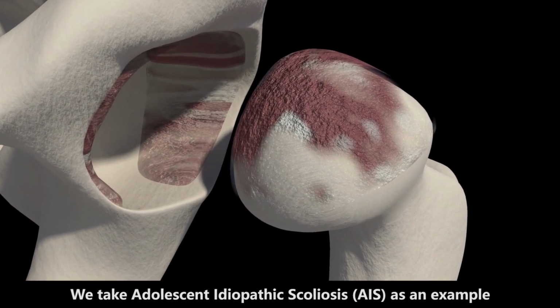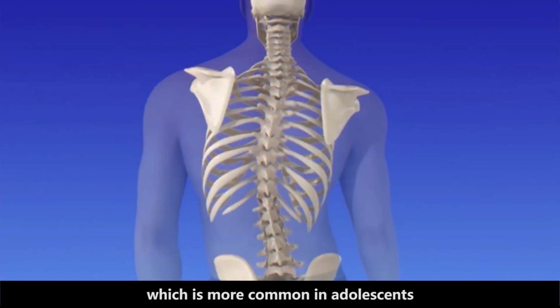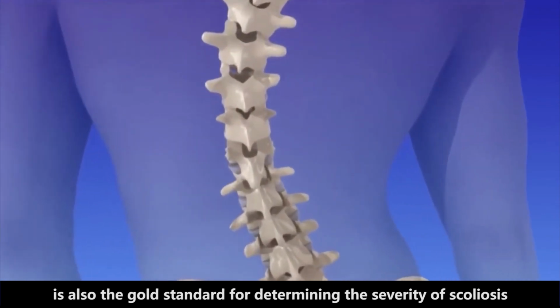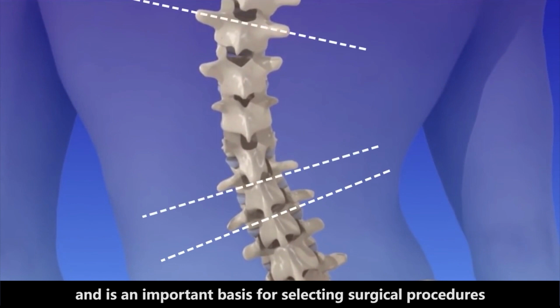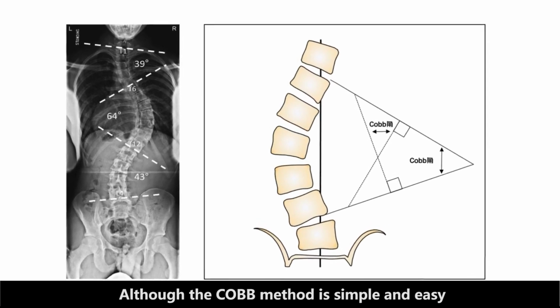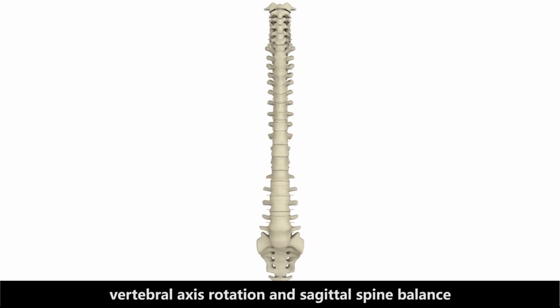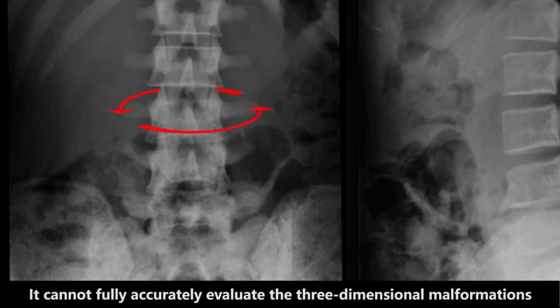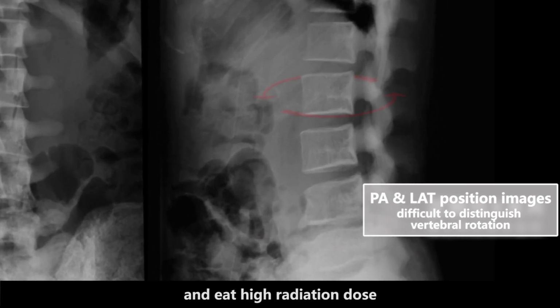We take adolescent idiopathic scoliosis as an example, which is more common in adolescents. Cobb angle measurement, as the most common method for detecting scoliosis, is also the gold standard for determining the severity of scoliosis, and is an important basis for selecting surgical procedures. Although the Cobb method is simple and easy, there are also defects. It ignores the three-dimensional space, vertebral axis rotation, and sagittal spine balance. It cannot fully and accurately evaluate the three-dimensional malformations. Patients often need multiple X-ray examinations and a high radiation dose.